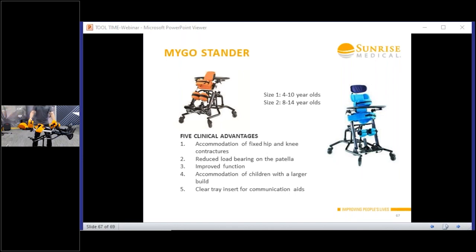Only one thing I didn't mention, and I apologize, I'll flick back quickly, just for the everyday seat, because you're going to be dealing with multiple carers and environments. So the main difference is, if you look at the front of the casters, you see they've got the grey tabs on them. Well, these are called directional wheels. So if you click them, you put them on, then they're going to click. That's click forward. And that was click forward.